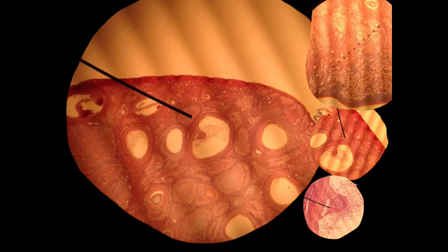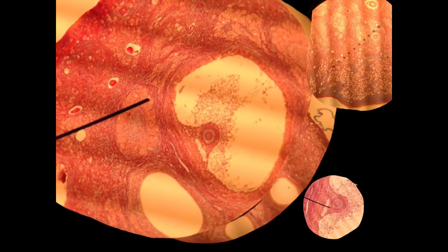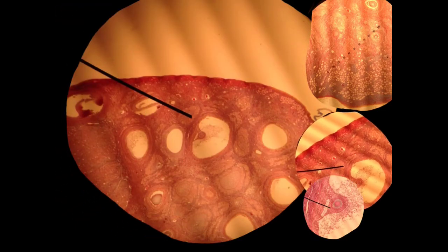Let's take a little bit closer look at that. Here's a little bit better resolution, a little closer look. Again, you can see clearly a tertiary or Graafian or mature follicle. There are many terms here, but this is what it looks like just prior to ovulation. Again, what's going on in the ovary overall is follicular development.